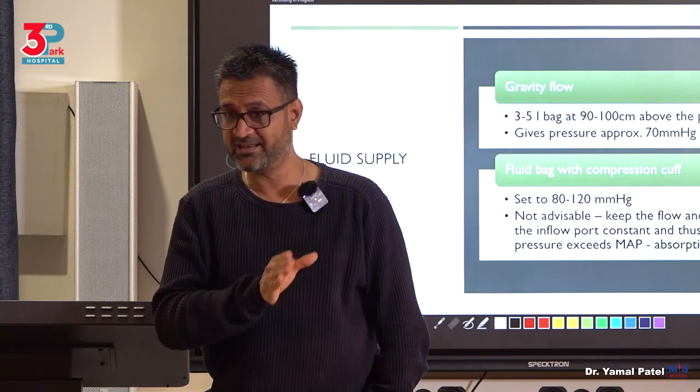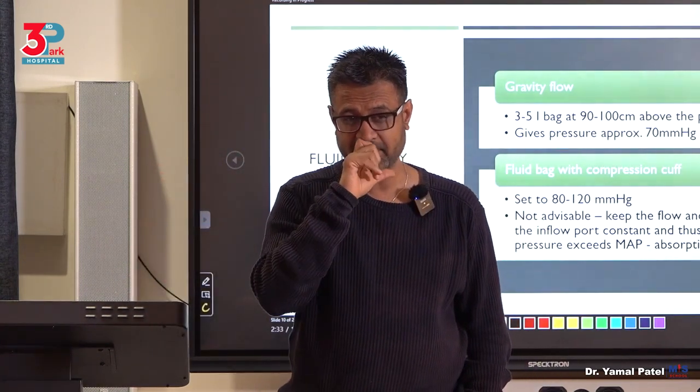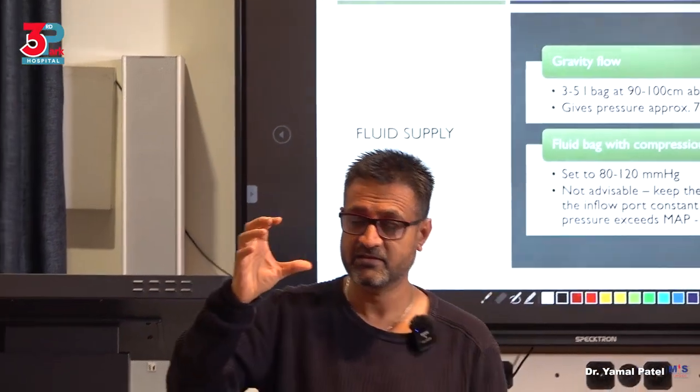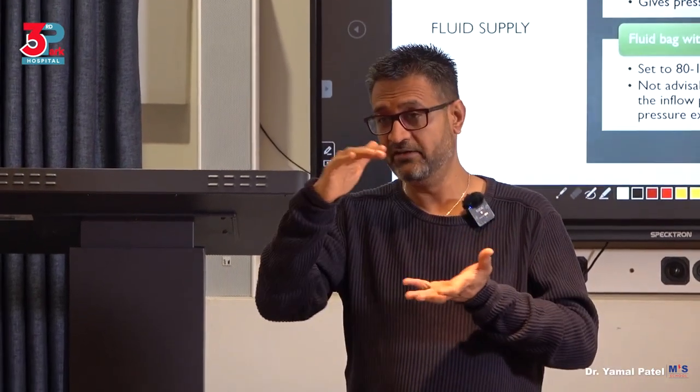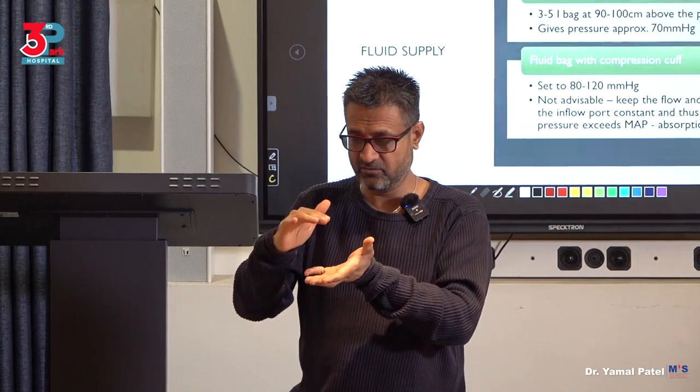Constant pressure, variable flow hysteroscopy. Okay? So what does that mean? At any given time, if you've put your setting at 100, you want your pressure always to remain below 100. You've understood.